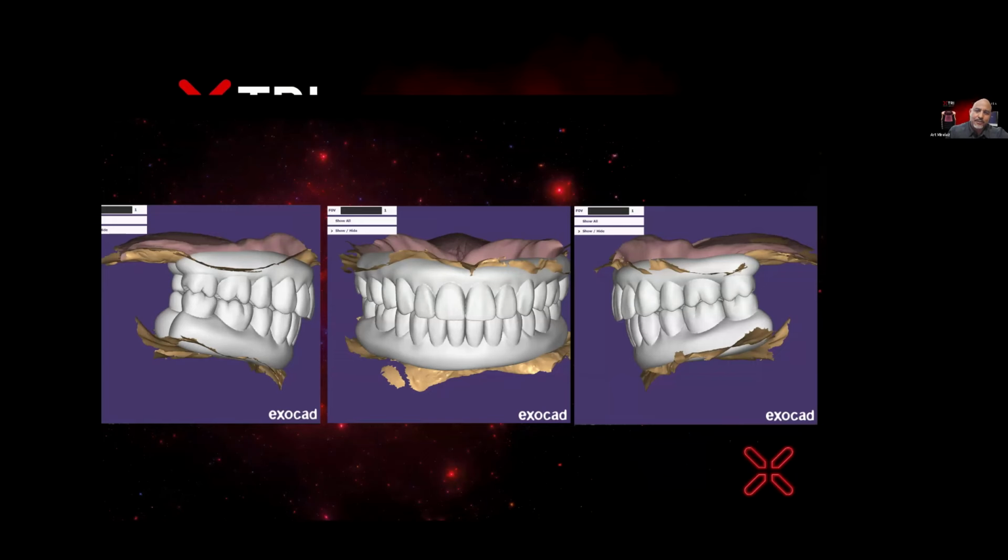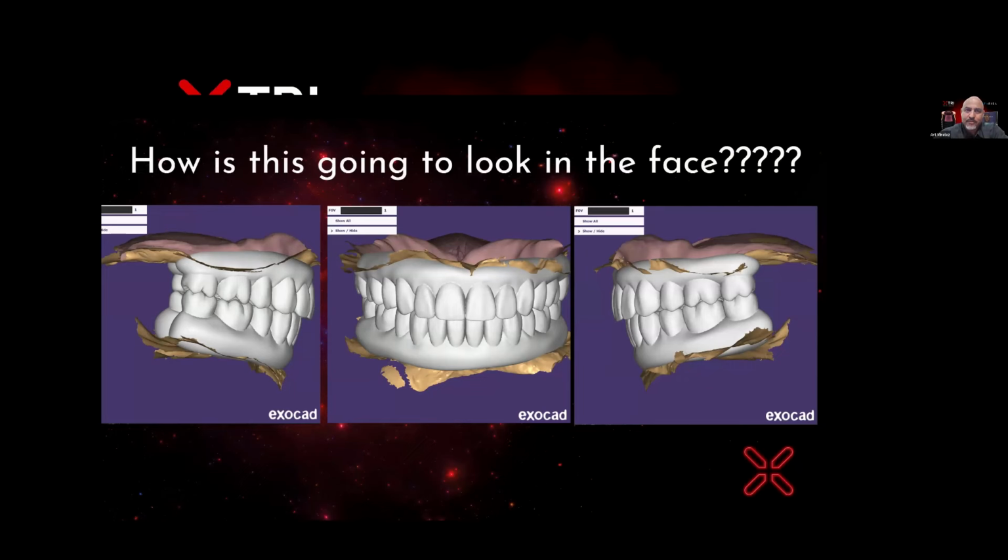So, people start saying, hey, digital dentistry is the answer. Well, let me tell you, I'll be the first to say that digital dentistry in itself is not the answer. For example, many people will look at this design and say, hey, that's a pretty nice design, I can get that design for $100, $150. But the truth of the matter is that we don't know what this design is going to look like until we put it in the patient's face.